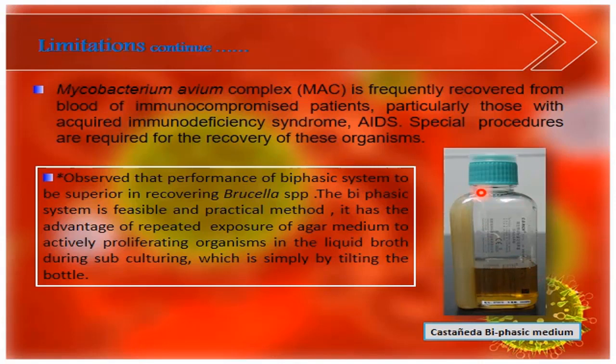The advantage of using the Castaneda blood culture system here for brucellosis is, firstly, to reduce the risk of transferring Brucella to the laboratory worker while opening the cap. Second, it reduces the incubation time from one month, as is standard with broth only, to 15 days, half the time.